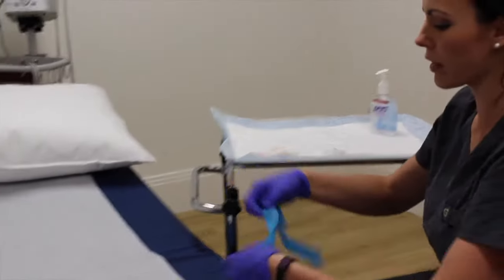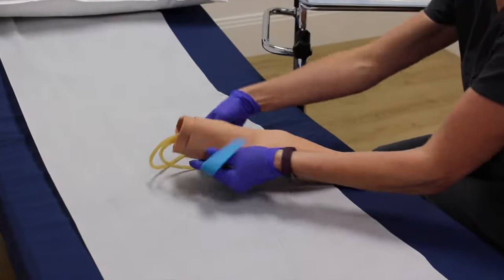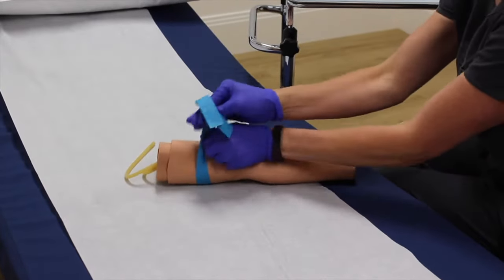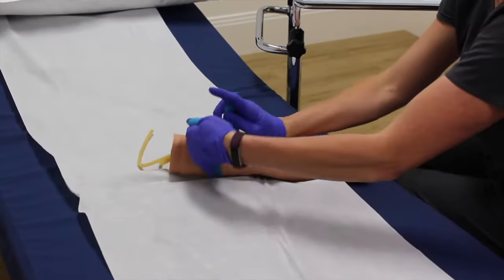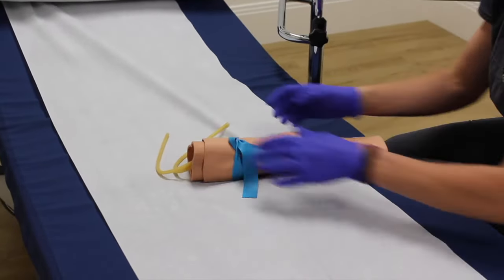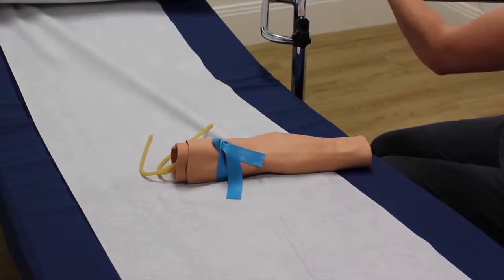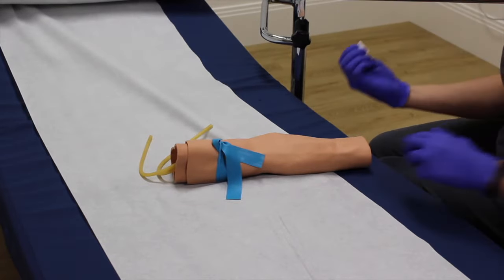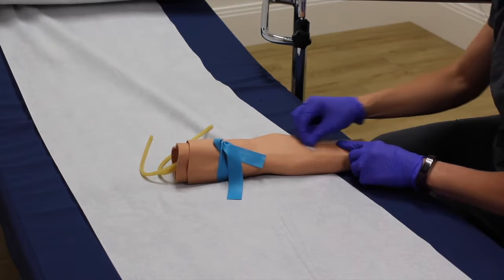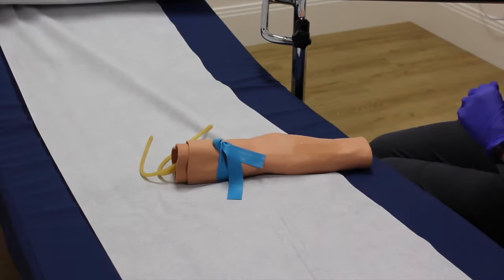You don't want to forget that. I'm going to put my tourniquet on my patient. I'm going to grab my alcohol wipe, locate where I want to go — nice and bouncy there, we'll go there. Clean it with alcohol and let it dry.